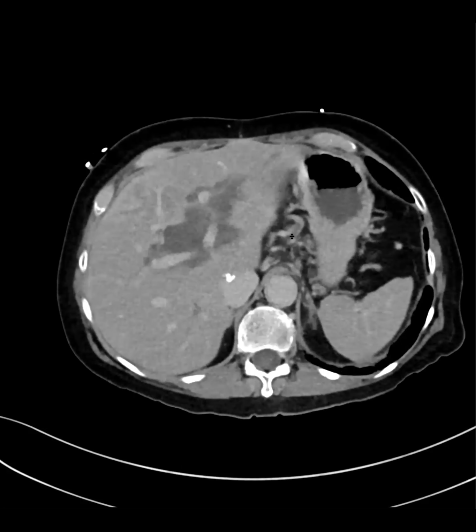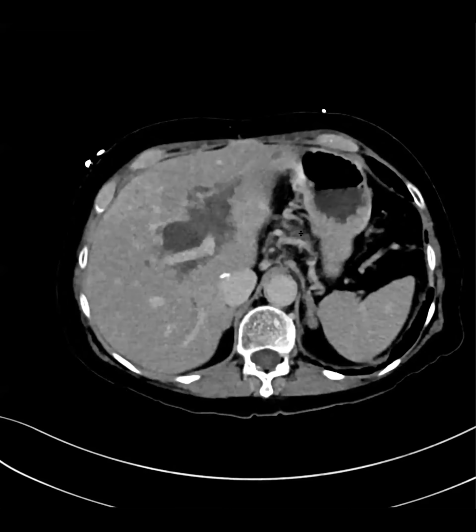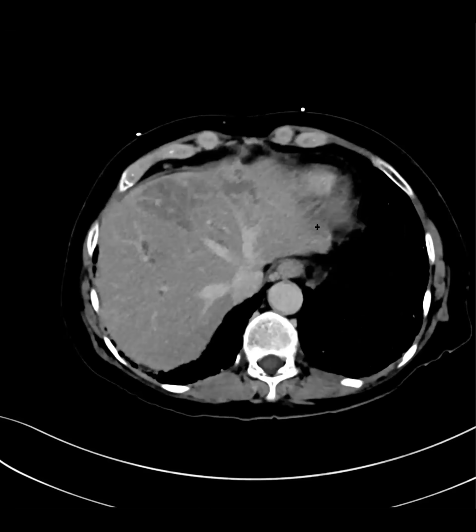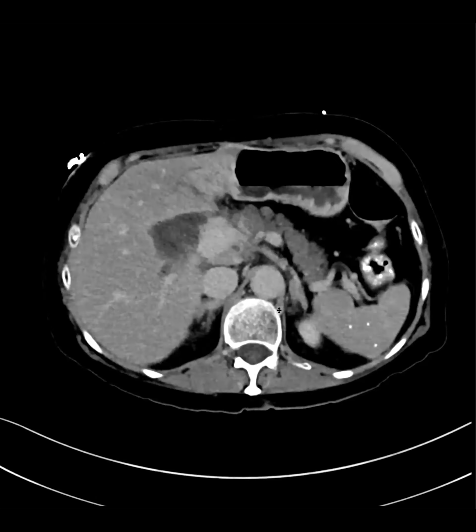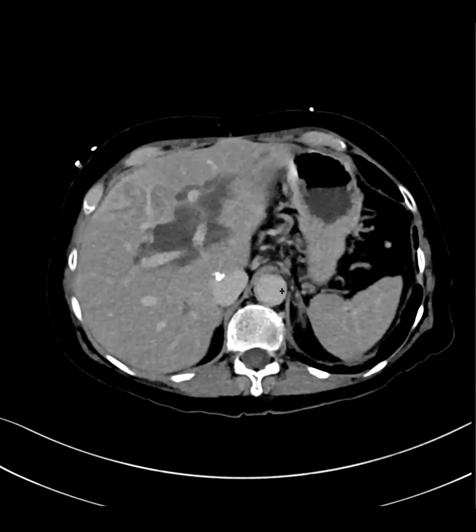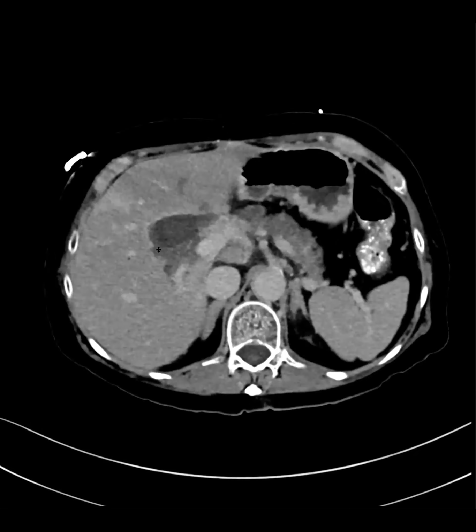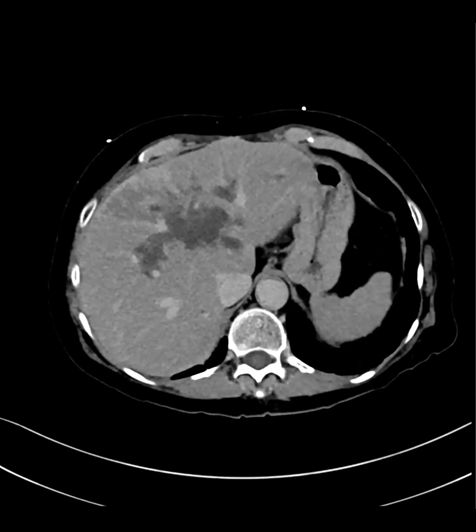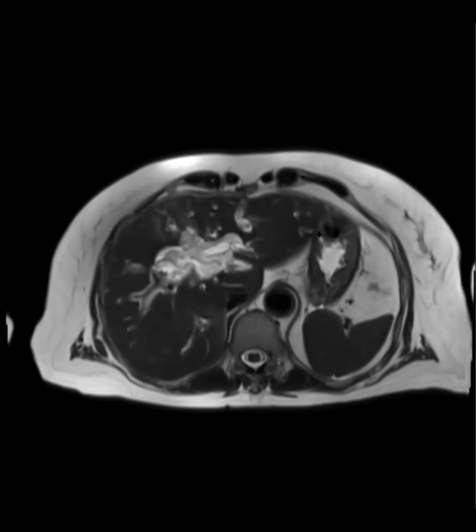I'm wondering about PTLD. I feel like all the fat planes are lost. Great thought. It also looks kind of fatty. Swachchhanda A is saying the patient is acutely sick. Okay, Swachchhanda is saying biliary necrosis. Yeah, exactly. So it follows the path of the central ducts. And so we got an MR, and the MRI is very impressive and looks like this.